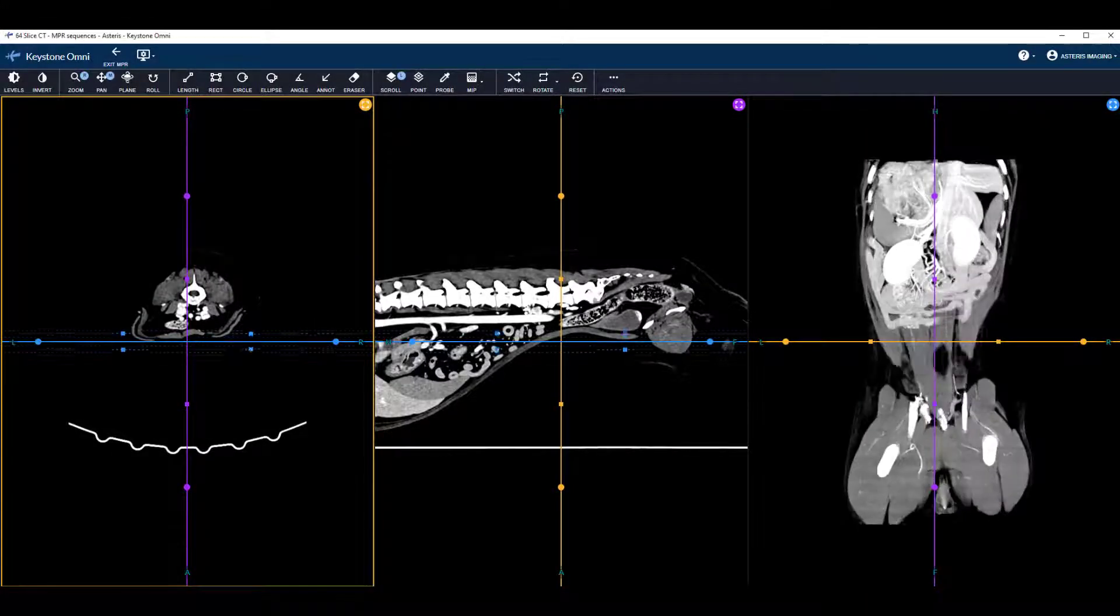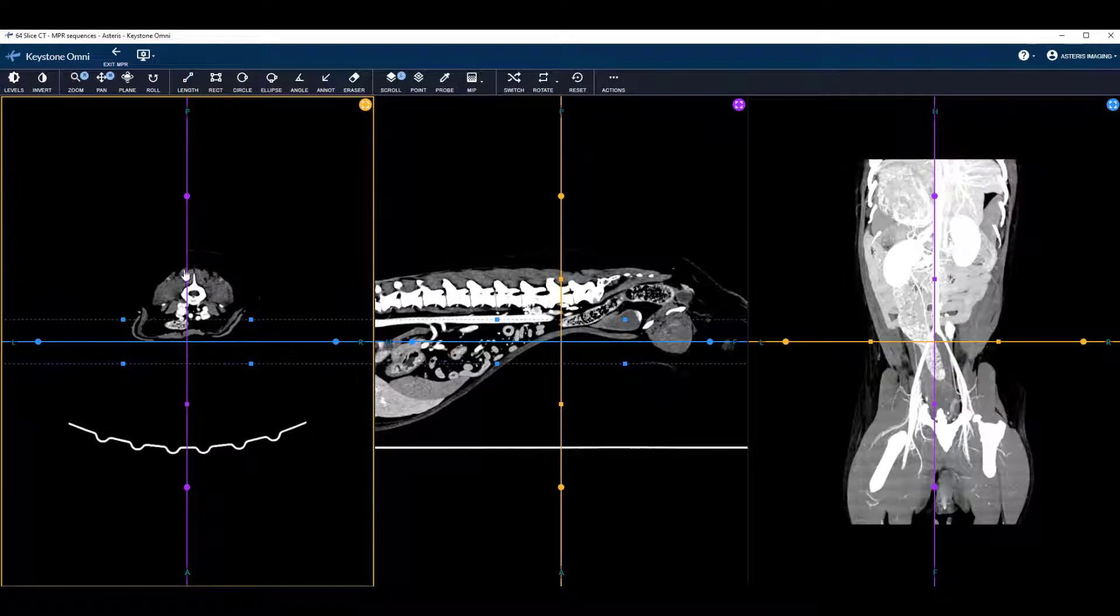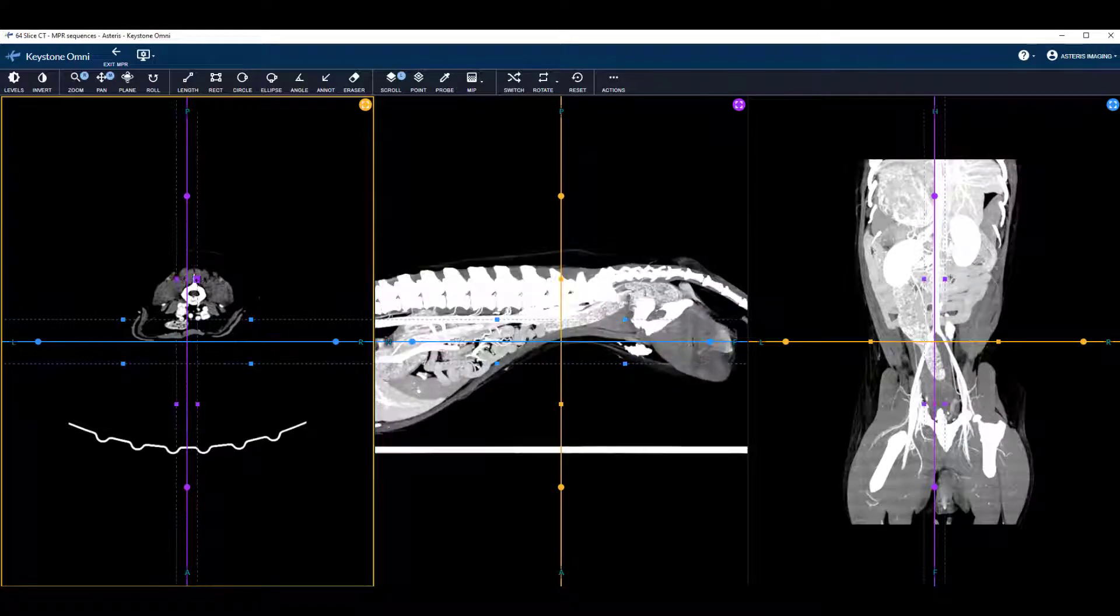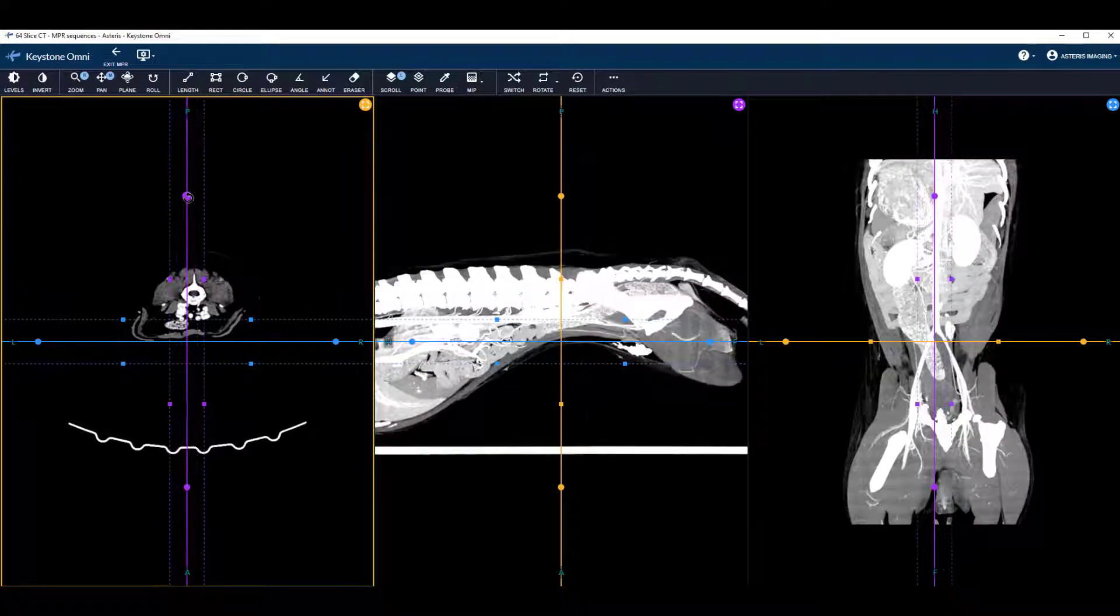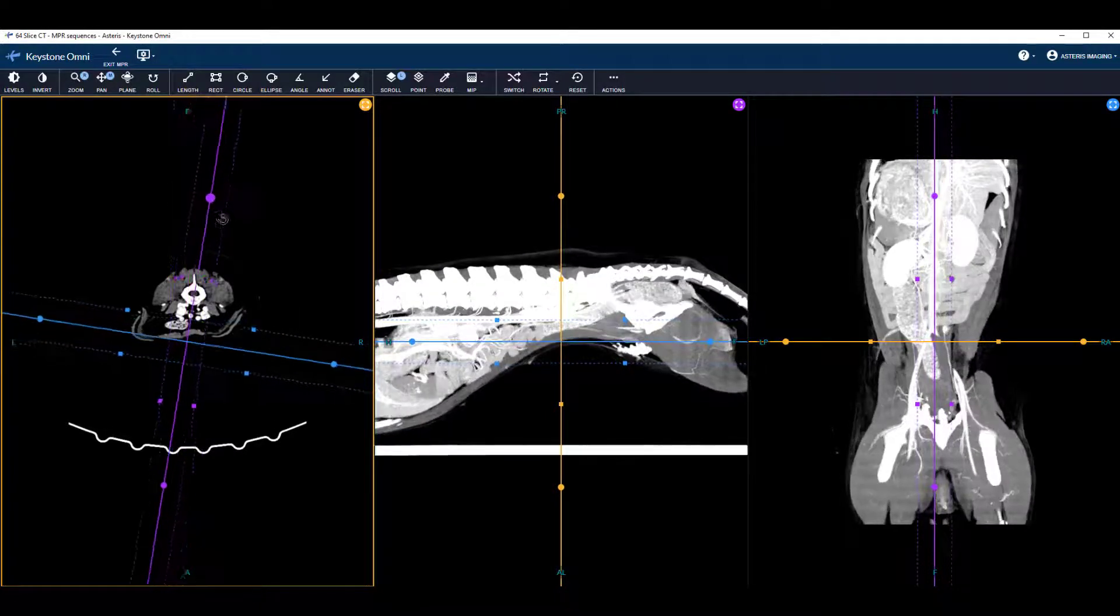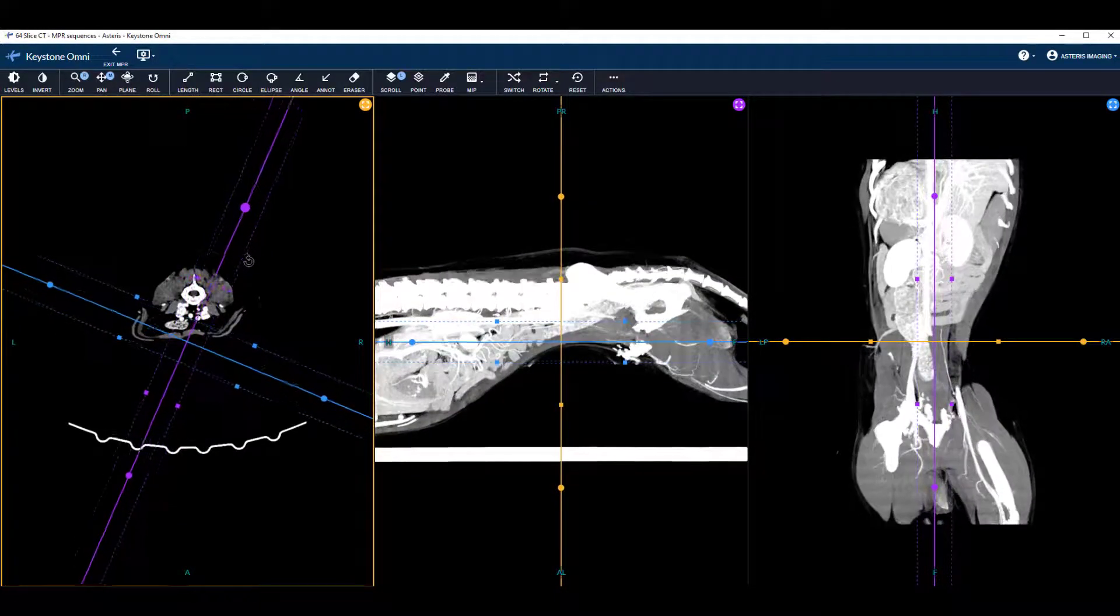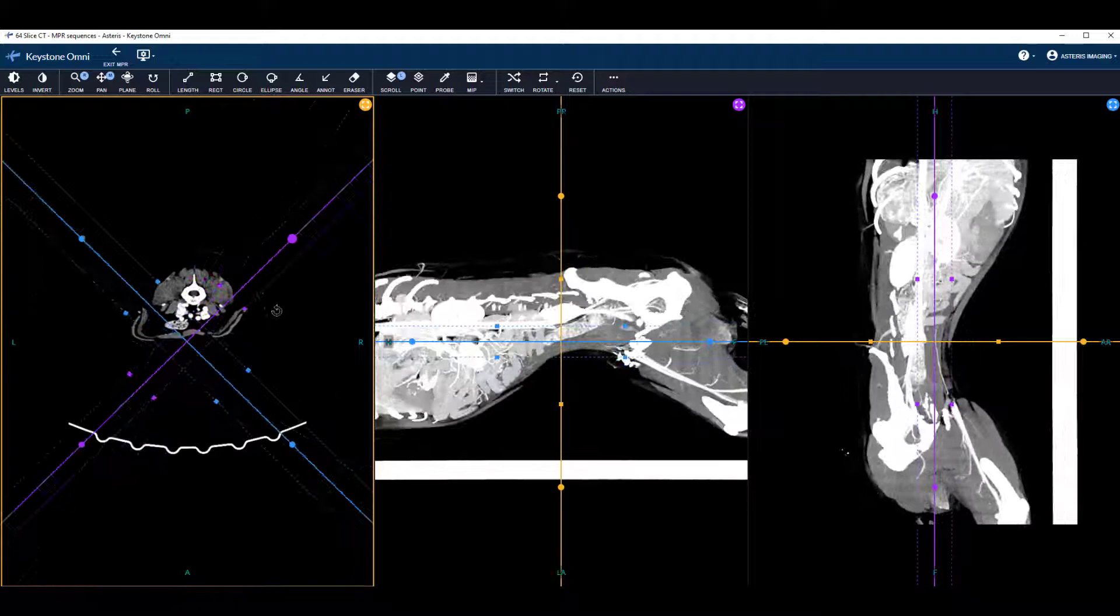Keystone offers an MPR tool that can be used to reconstruct CT sequences into axial, sagittal, and coronal planes.